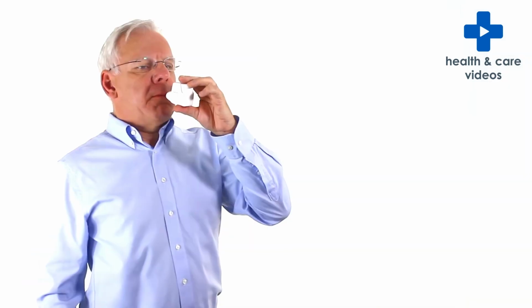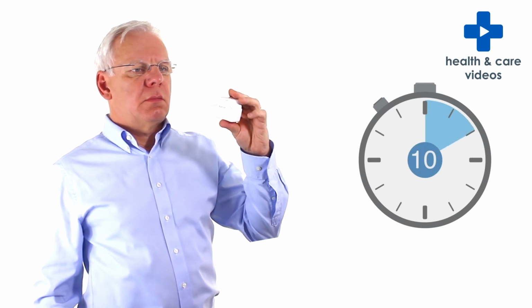Remove the inhaler from your mouth while holding your breath for up to 10 seconds, or for as long as is comfortable. Breathe out slowly, but not into the mouthpiece.